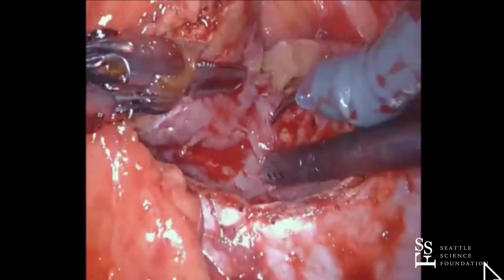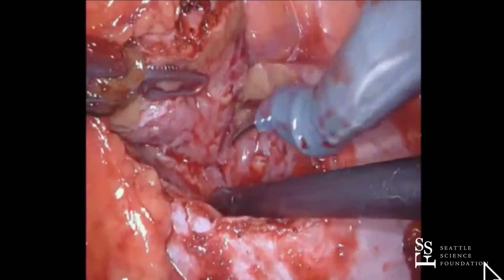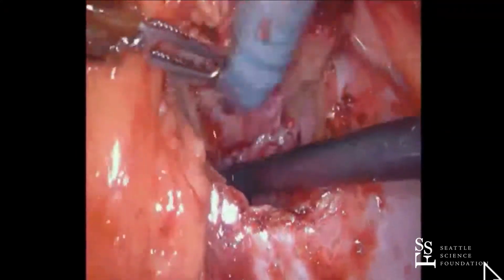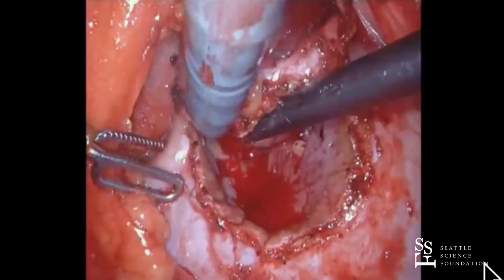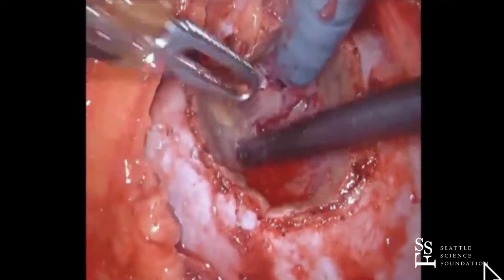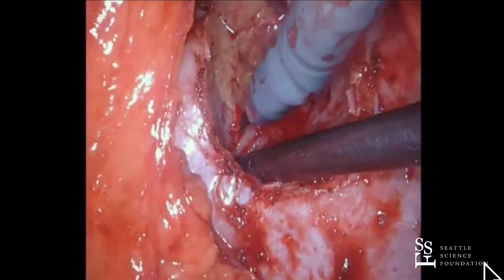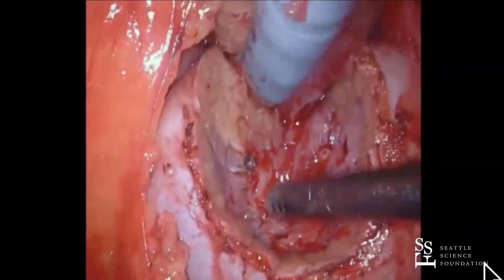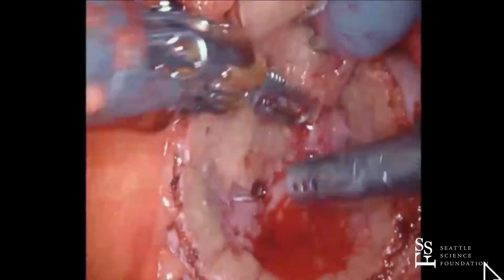So notice how he flipped his scissors over. When he got to the deepest portion, he went curve up. So that was how he was going to try to make the turn to start going up now. See how he's flipping it, and then he'll start taking the curve up. This is just a nice example about how Jim's mind, because he's done so many of these, has already thought about the 3D nature of the tumor. He's got a 3D picture in his mind of where the tumor is and how deep he needs to go and when he needs to start coming up. So this is a beautiful example.